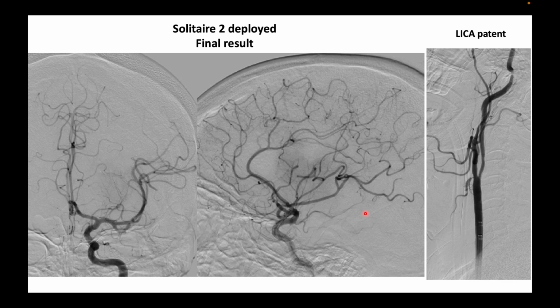So we did Solumbra, that's a Solitaire. That stent was deployed here and then it was pulled out along with suction going on. That's Solumbra, and the middle cerebral artery was fully recanalized.